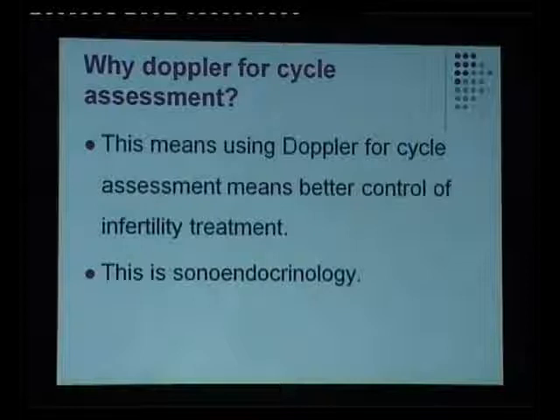Ovarian flow correlates well with oocyte recovery rates, and hence may be useful in determining the most appropriate time to administer HCG to optimize the oocyte recovery rates. Therefore, this vascularity must cover at least 3/4 of the circumference of the follicle. Not only that, these vessels must also have an RI of less than 0.48. You can remember a round figure of 0.5, and a PSV of more than 10 centimeters per second. And this is more important in decision making than just the size of the follicle.